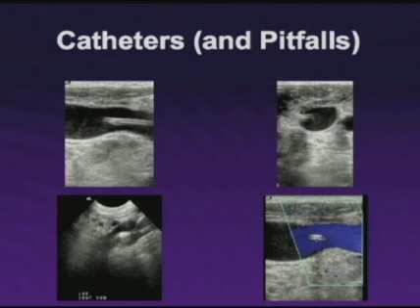Here we have a catheter present within the vein, and we can see low-level echoes lying in the lower portion of this vein. This is not reverberation, as the echoes are not in the upper part of the vein, and you can see here on the short axis view that again the upper portion of the vein is anechoic, and this represents pericatheter thrombus.